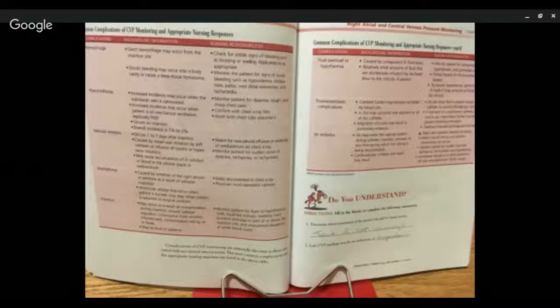Air embolus: air enters the vascular system during catheter insertion, removal, or any time during which the tubing is being disconnected. Collapse and death may result. In alert patients, the Valsalva maneuver is the appropriate response. They're pretty much coughing while closing the glottis. Monitor the patient for sudden cyanosis, tachycardia, and hypotension.